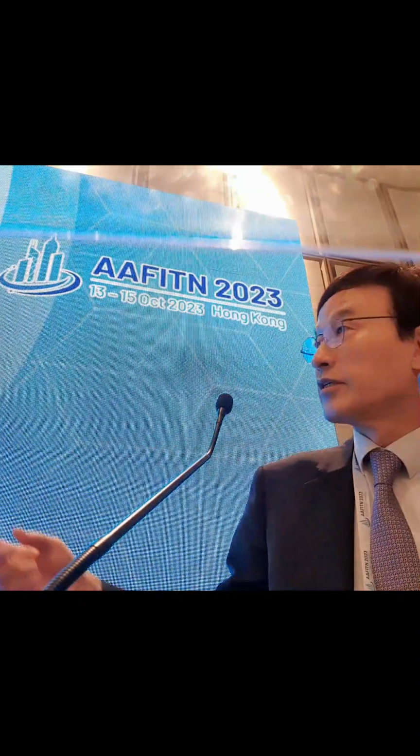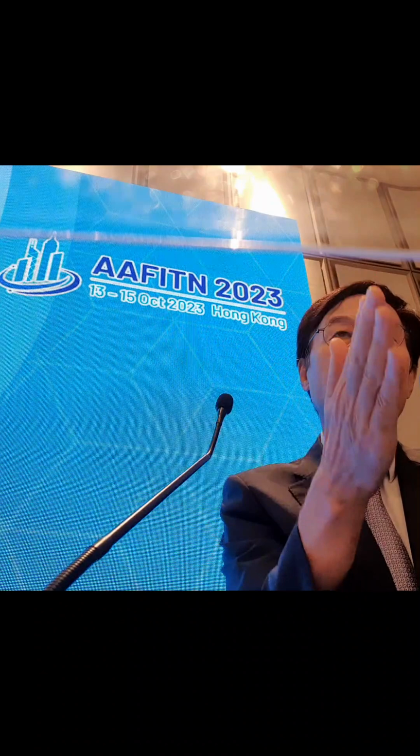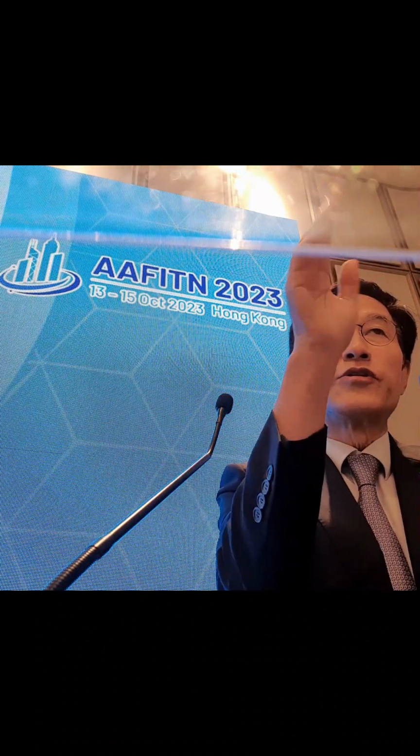For this peculiar anterior choroidal aneurysm, I don't have a pointer here, so maybe you can see well. The anterior choroidal artery on the left side is separate from the aneurysm, but in the other angle it comes out of the aneurysm. So it means that if we embolize it, we should make a triangular-shaped vacancy in a little larger area. Even 3D angio couldn't show that relationship exactly.